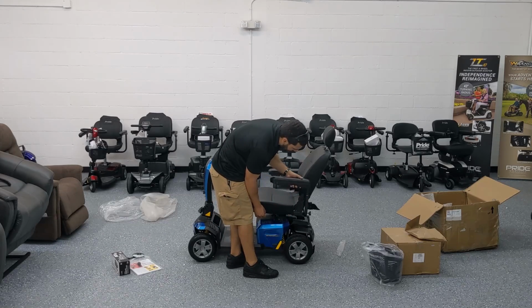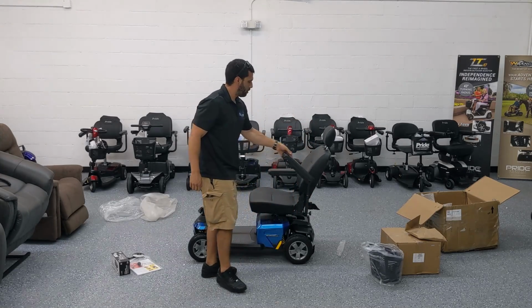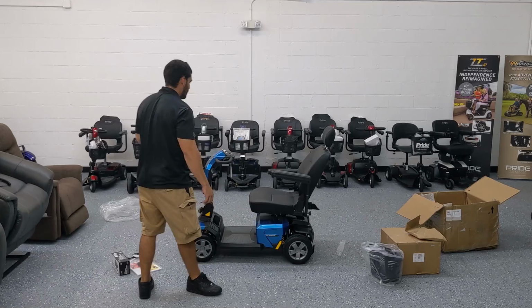And you can adjust the height. So if you want it really high up, you simply hold it where you want it and tighten this thing, give it a few twists until it doesn't slide down anymore. And you'll see that it stays right where you want it, with several adjustment points, basically giving you about, looks like 6 inches of adjustment range for the armrests.